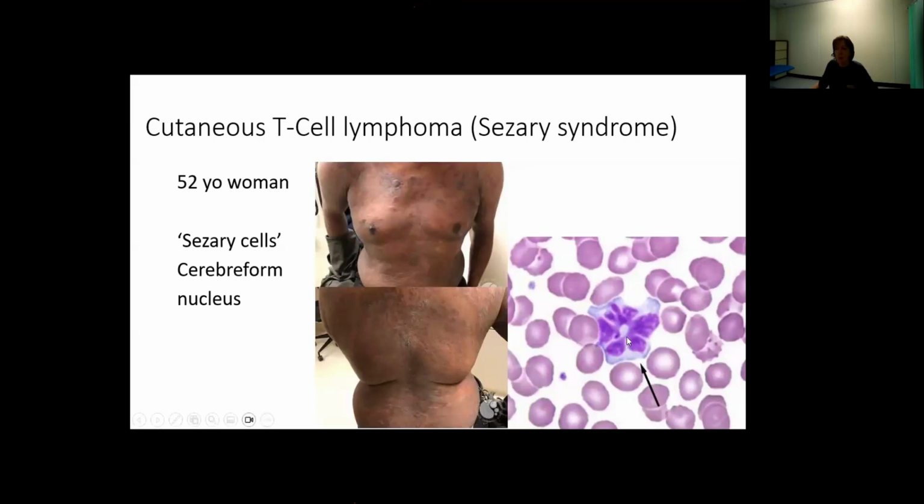So again, if you see one of these, it's often irrelevant, or it may well be due to the slide preparation. But if you're seeing lots of them, then it suggests there's something else. But quite often with these patients with cutaneous T-cell lymphoma, they often have very marked skin involvement with rashes or patches, or they can be diffusely erythrodermic, so that they have skin involvement throughout.